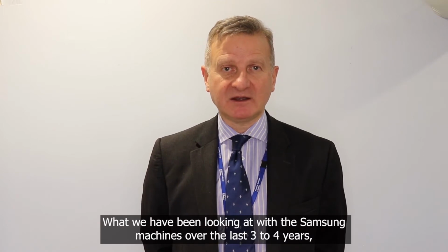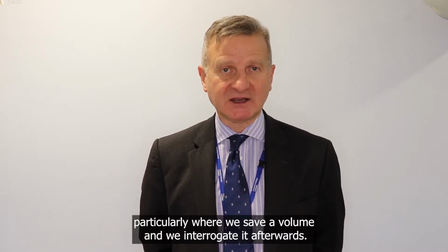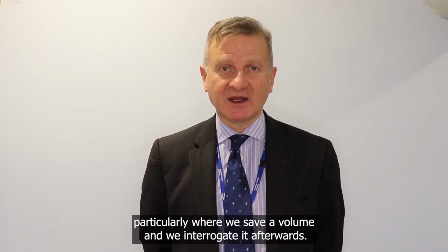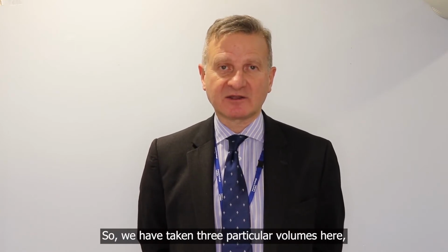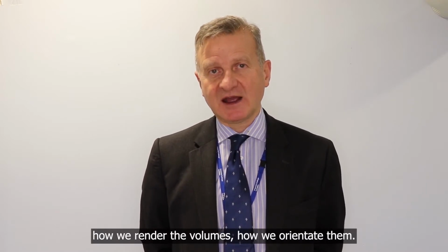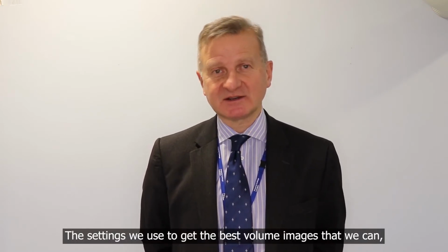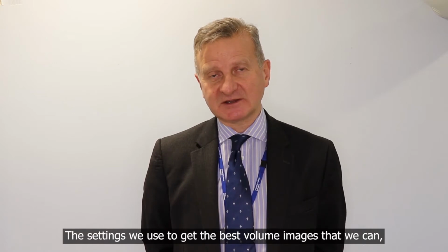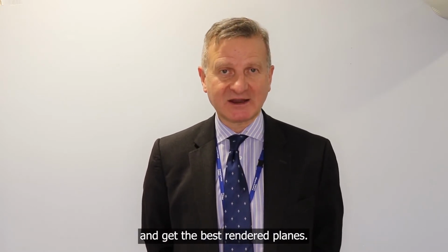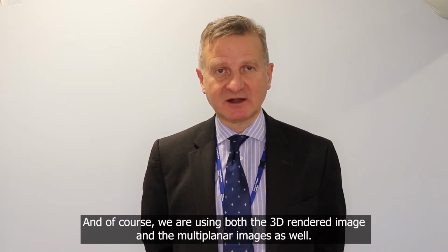What we have been looking at with the Samsung machines over the last 3 to 4 years is using the combination of CrystalVue and RealisticVue, particularly where we save a volume and we interrogate it afterwards. So we have taken 3 particular volumes here, and you'll see Dr. Dall'Asta showing you through how we render the volumes, how we orientate them, the settings we use to get the best volume images that we can and get the best rendered planes. And of course we're using both the 3D rendered image and the multiplanar images as well.